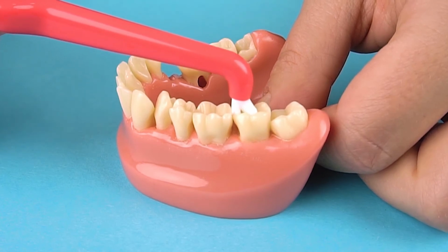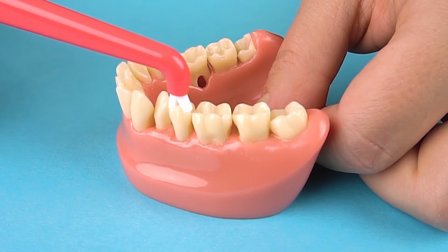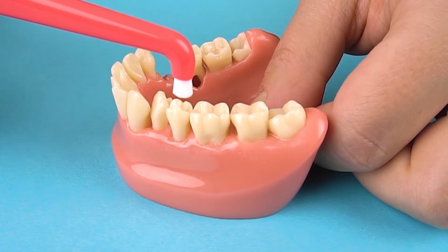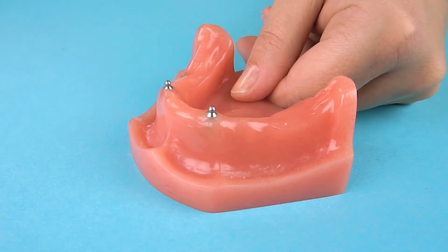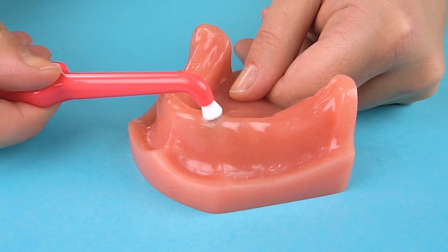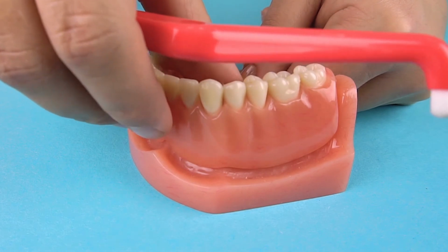When using on the top of the tooth, hold the brush tip at a 90-degree angle towards the biting surface of the tooth. Move the brush tip gently with small, circular movements. This will clean the grooves and help prevent cavities. When cleaning around orthodontic appliances, implants, or attachments for overdentures, use minimal pressure to flare the bristles outward, moving in a back and forth motion.